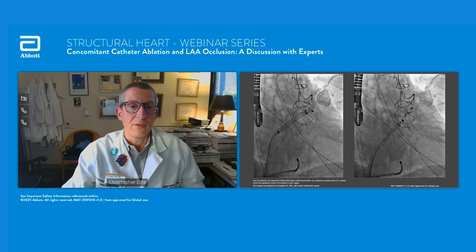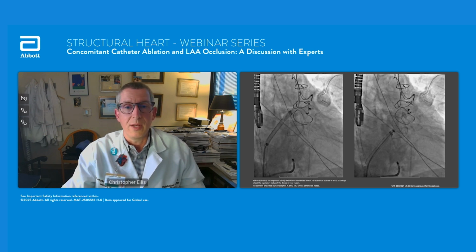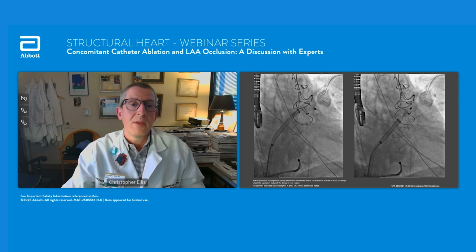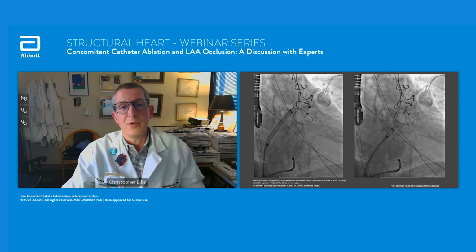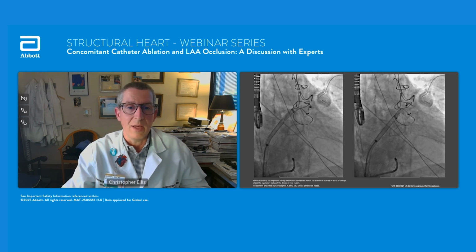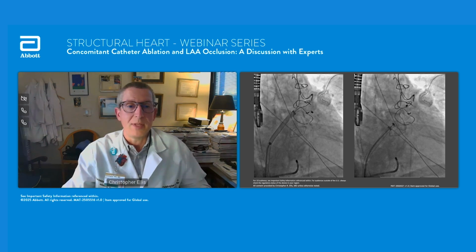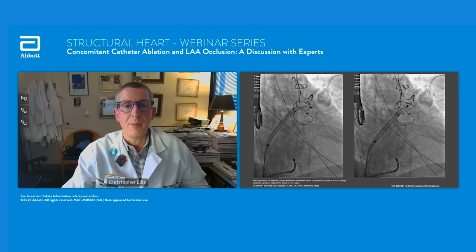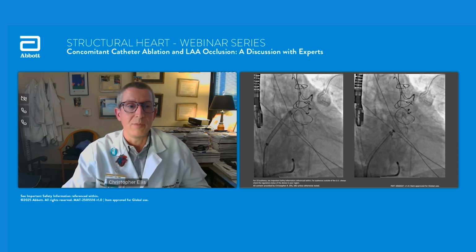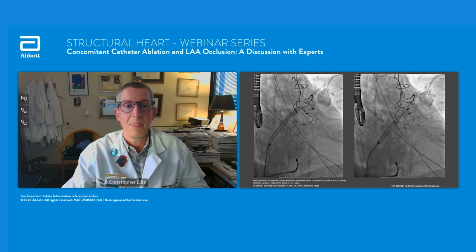And I think one of the things too is, if you're planning on doing right atrial ablation, that is to say SVC isolation or typical flutter line or dealing with something else, do you like to finish up what you're doing in the left atrium, like do PVI, posterior wall, close the appendage and get out of the left, then deal with the right? Or do you do the veins, posterior wall, pull into the right atrium, go up to the SVC, do the SVC, maybe drop a flutter line, and then go back through the same hole back into the left atrium to place the Amulet at the very end of the case? What's your approach on that?